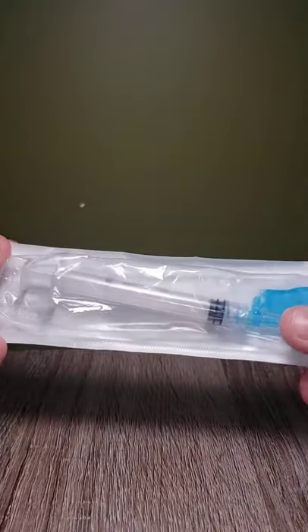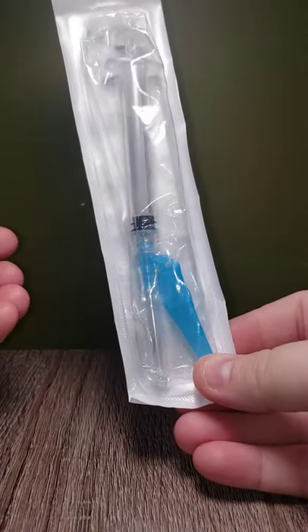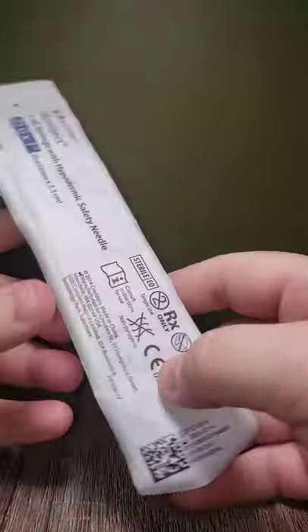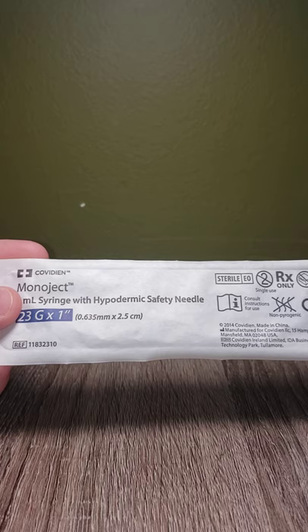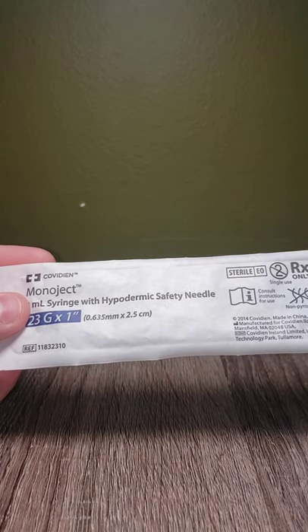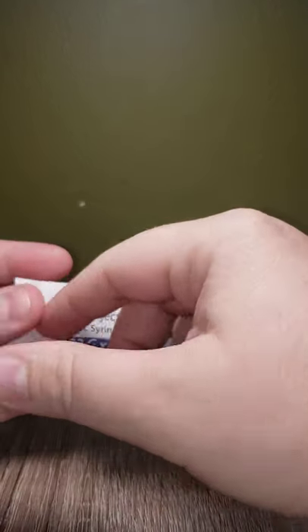Hello and welcome to NextGenRN. Today I'm going to be going over the basics of a syringe, exactly what a syringe is made out of, so that you know all the parts. This will get you ready for your clinicals or your lab, or if you just need a quick reference. So let's check it out.